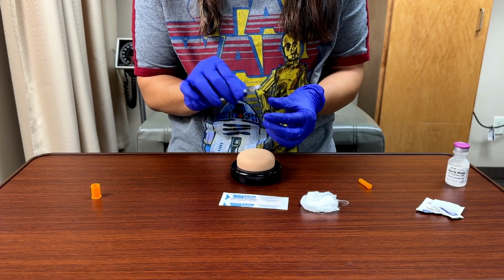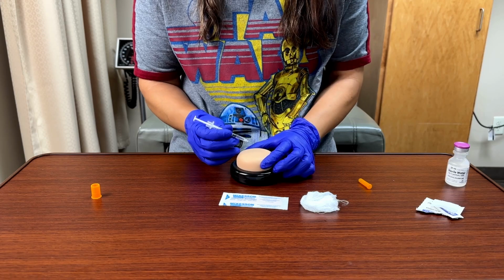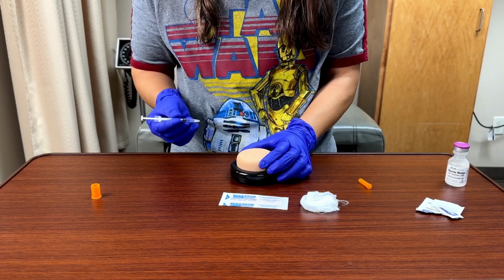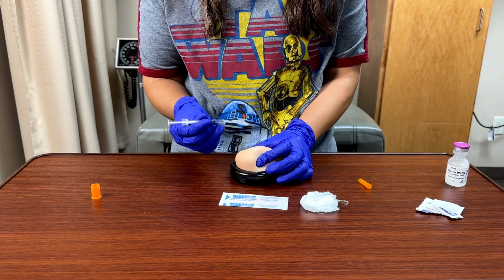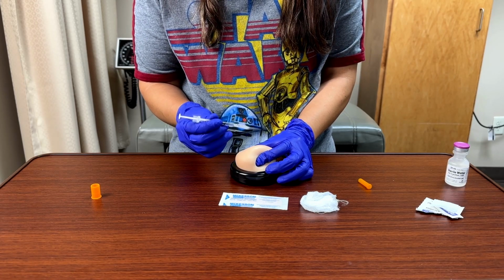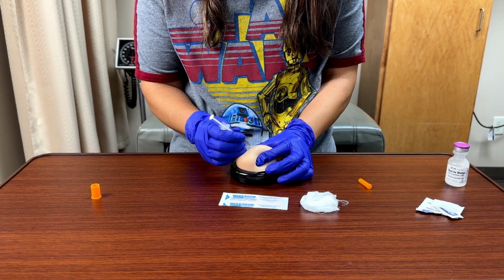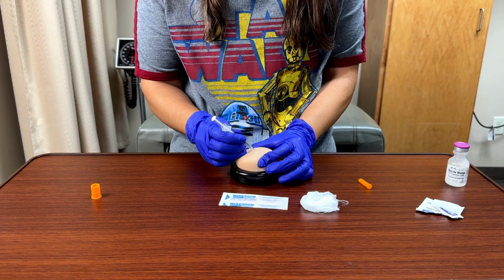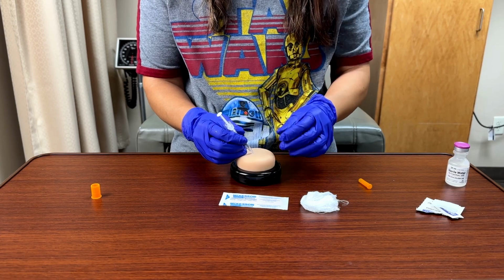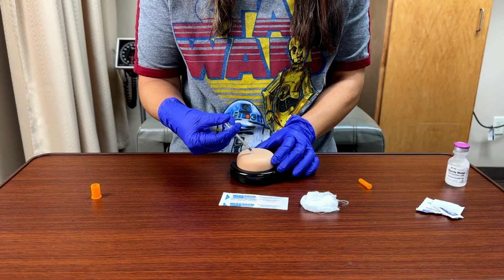So usually I kind of do something like this, and I hold it like this, okay? So I have the bevel facing up. I'm going to pinch the skin because I want to grab the fat. It's going to be into subcutaneous, not into the muscle. So I'm going to pinch the skin like this, and then I'm going to insert it bevel up at about 45 degrees, okay? Once it's in, I'm going to release the pinch of the skin, pull out the plunger to make sure I'm not in any blood, and then I'm going to gently push the medication.